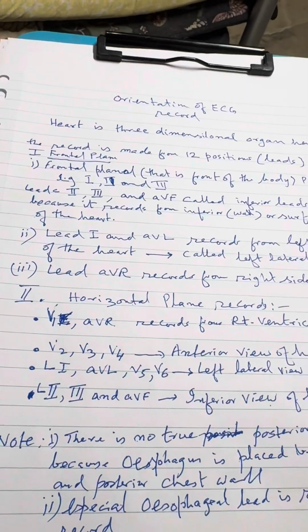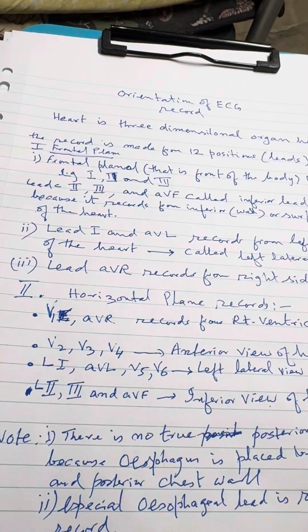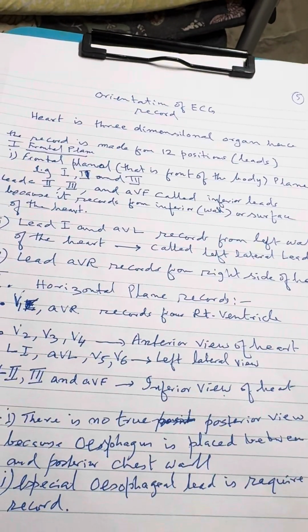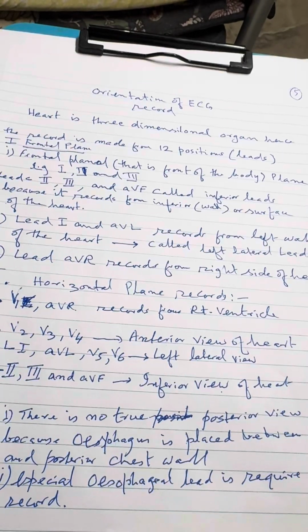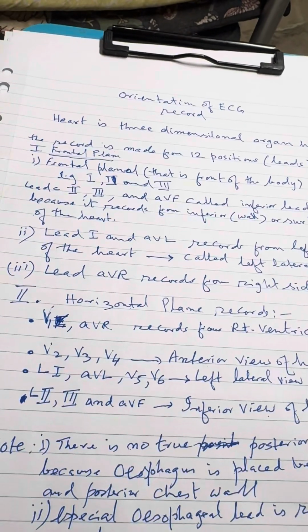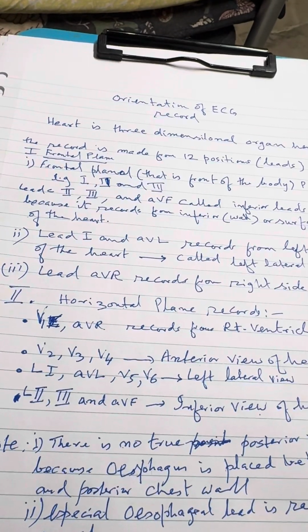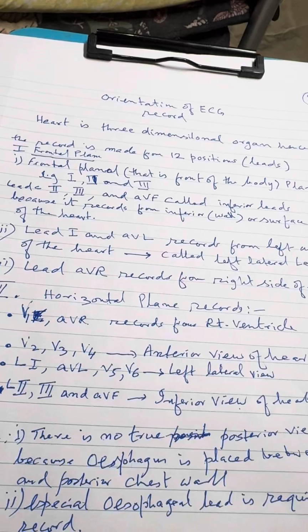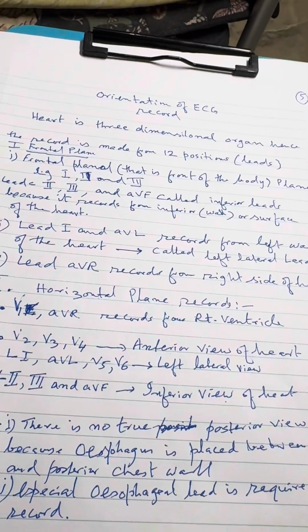Now, V2, V3, V4 records from the anterior surface of the heart, from the anterior view of the heart, while lead 1 and AVL and V5, V6 is lateral, is giving lateral view of the heart.